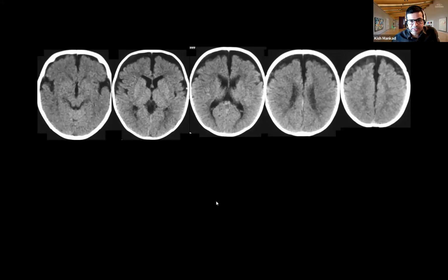One of the things that you will really face a lot in your practice is increasing head circumference. When children increase their head circumference in the infant period, at least around 4, 5, 6 months, it's a very rapid increase and it's very scary at times. So scary that you want to get some investigation done. You can get a CT, an MR, or an ultrasound, and you encounter a situation like this.